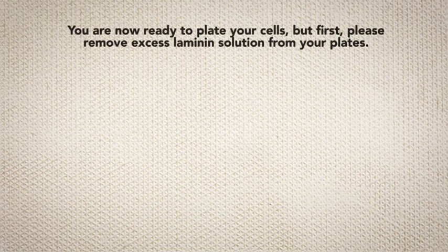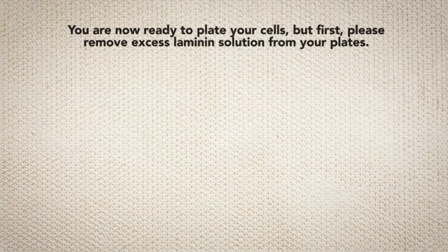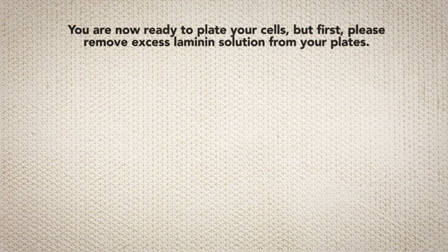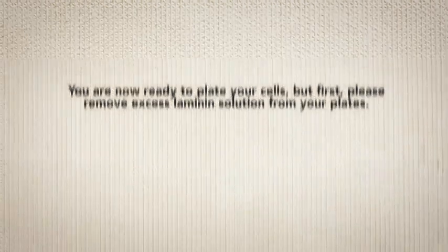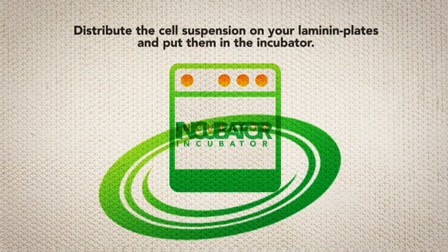You are now ready to plate your cells. But first, please remove excess laminin solution from your plates. You can save and reuse the solution. Distribute the cell suspension on your laminin plates and put them in the incubator.